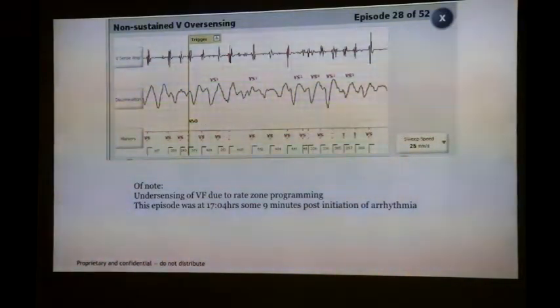But I have this notion. None of us are very highly experienced. Maybe we're not like Professor Rodney, Professor Berman. So I think stay with the default. On that Abbott device, stay with the default. It works really well. If you want to change it, you need to have a really good reason to change it, and get back to somebody.